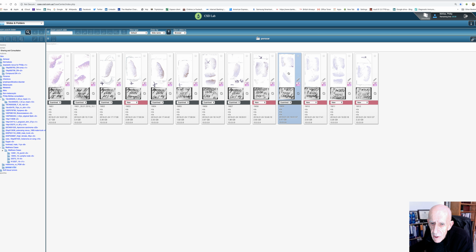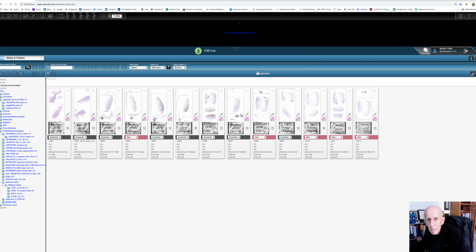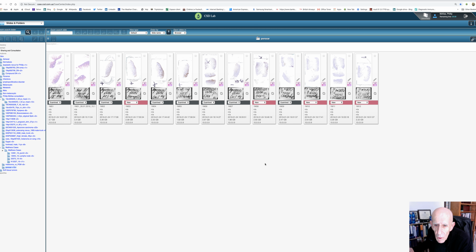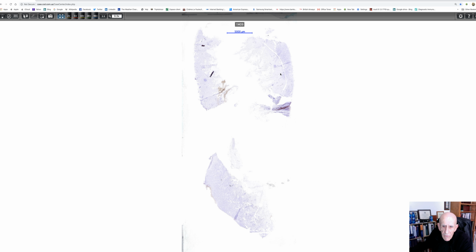Antonina is obviously a great immunohistochemistry fan, as most of you are. It's something I've noticed when I look at your cases on McKee derm. I end up totally bewildered at all of the immuno you order, none of which I've ever heard of. So I find myself at a great disadvantage. Well, it looks as if CEA is negative, so I'm not going to worry about that too much.